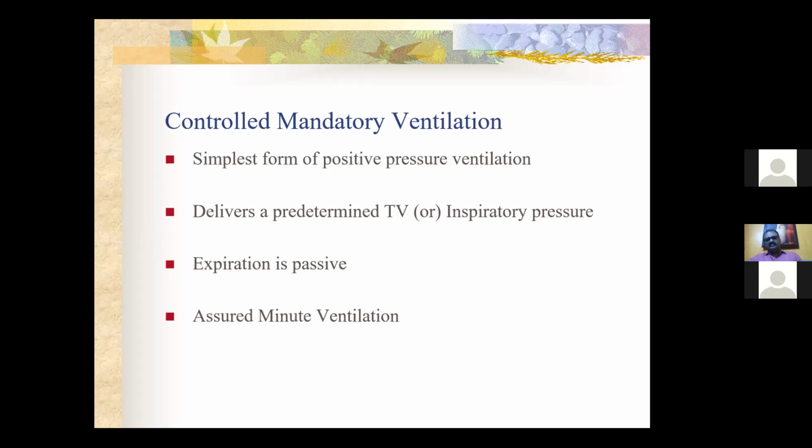One delivers a predetermined tidal volume, that is the volume control mode. And when you deliver a predetermined pressure rather than the volume, that is a pressure control mode or pressure control ventilation, pressure CMV, PCV.